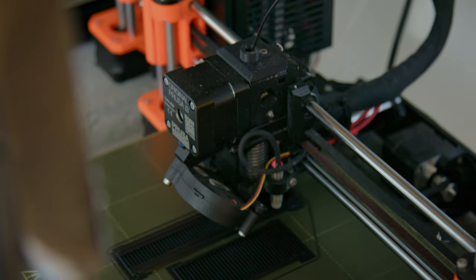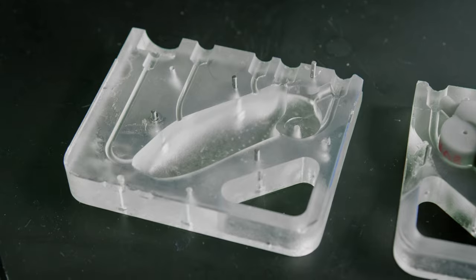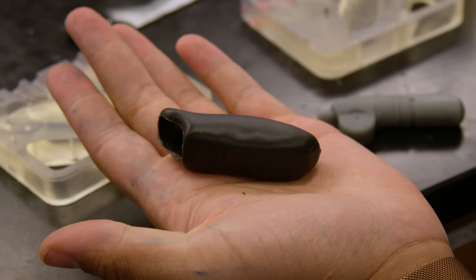With FDM printed molds, molded items would end up with these odd striated striped textures on top. Once we switched over to using clear resin, we were able to obtain a much smoother surface finish because of the much higher resolution.